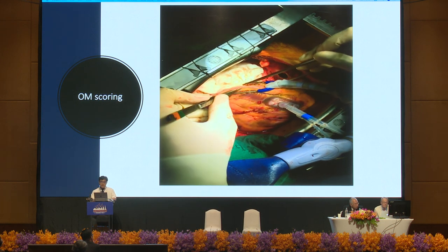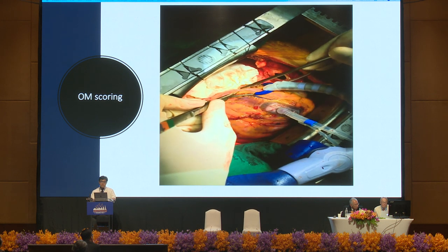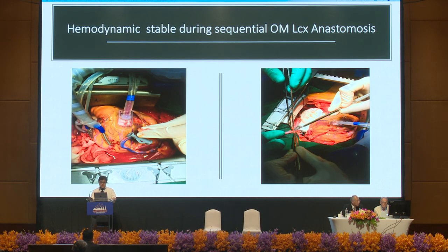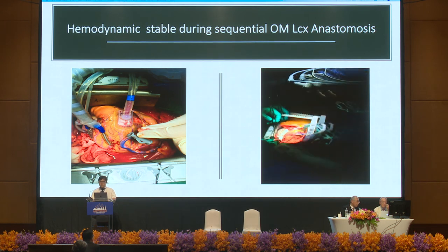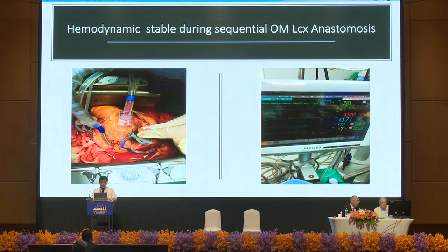This is my colleague who did the OM anastomosis. This is Dr. Bunsap. She's a lady, but she can also perform off-pump very well in our unit without rush. So you can see, off-pump, most of the case exposure is not that bad if we get used to it and adopt this technique and keep learning from experienced doctors, like we got the support from the Japanese Association.